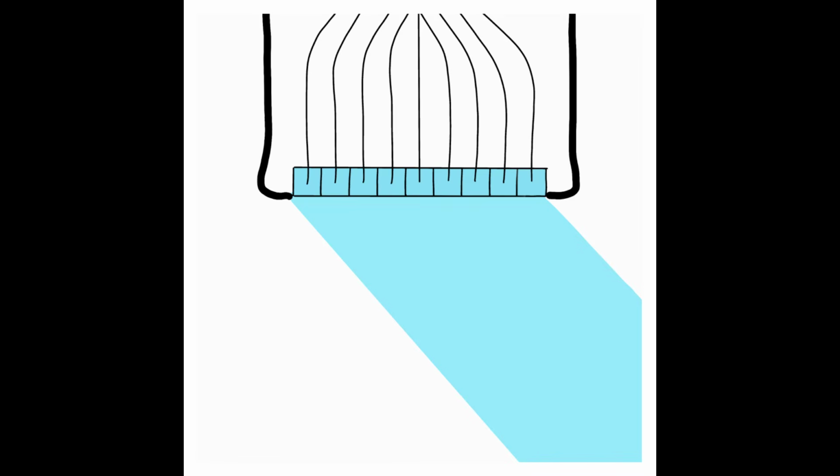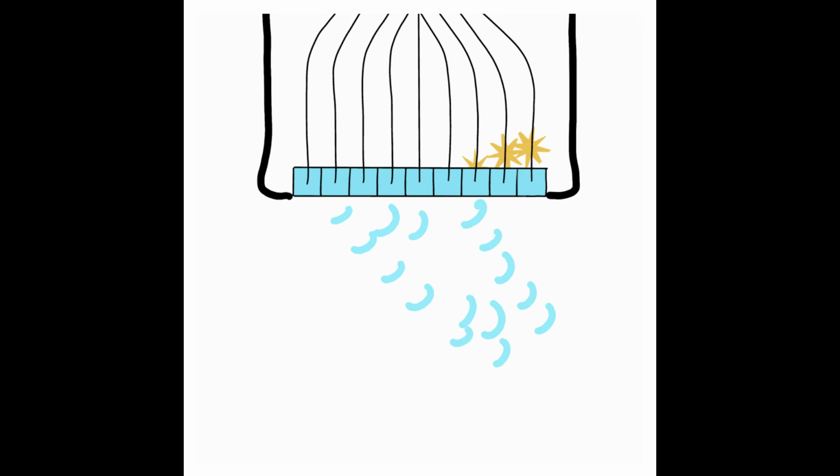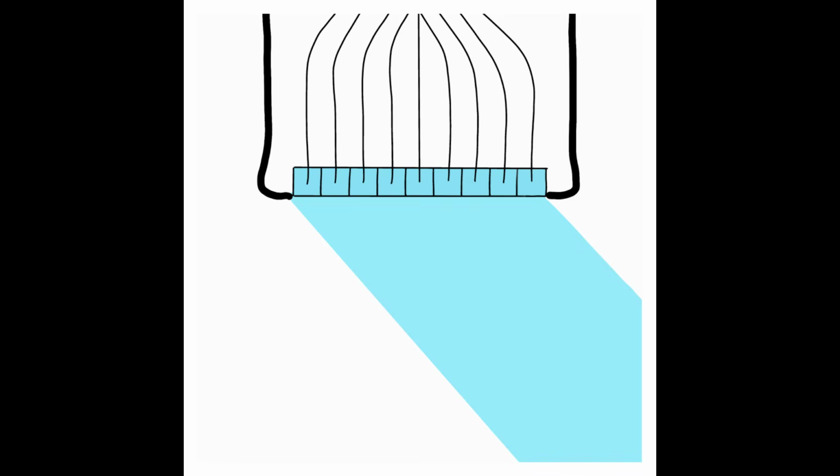So the biggest thing that you need to look for is, is there a slope? If there is, we're going to have a steer. Connect your first and last pulses, draw a line straight out from that connection, and that's going to give you the direction that the beam is steered. A steeper slope is going to cause more of an angulation of steer, while a flatter slope is going to cause the beam to not be nearly as steered away from center as it would be with a steep slope.